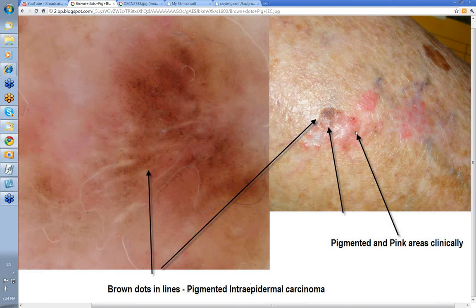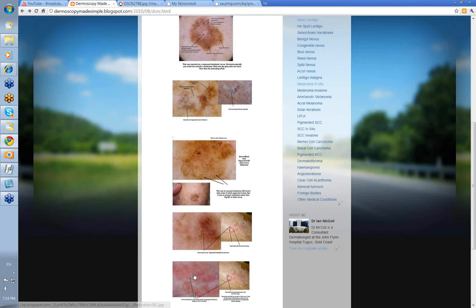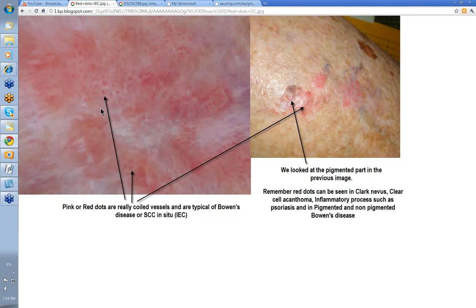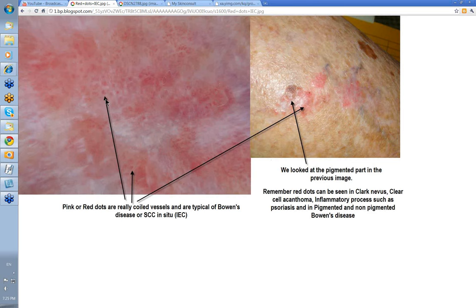Now we should look at the pink areas of that same lesion. Here's the pink area — you might call these red dots, or you might call them red clods. In fact they're a bit big for dots, because these are really coiled vessels. These are the typical coiled vessels that you'll see in Bowen's disease or SCC in situ. Remember you can get red dots in Clark nevus, clear cell acanthoma, also inflammatory processes such as psoriasis, and both pigmented and non-pigmented Bowen's disease. So you may interpret these initially as red dots, but they're actually coiled vessels.